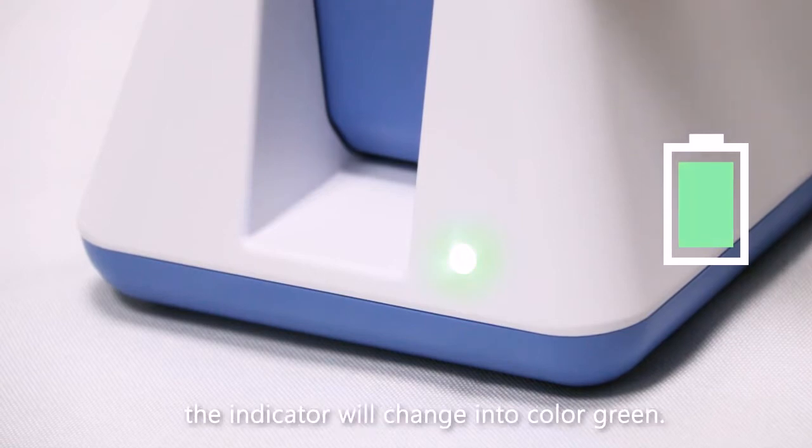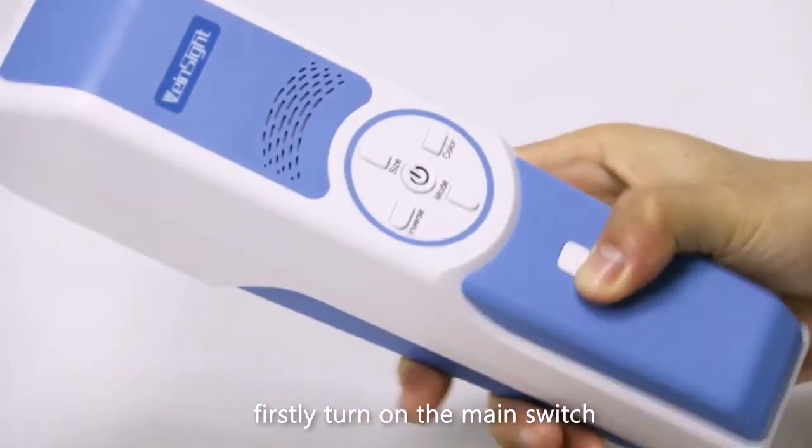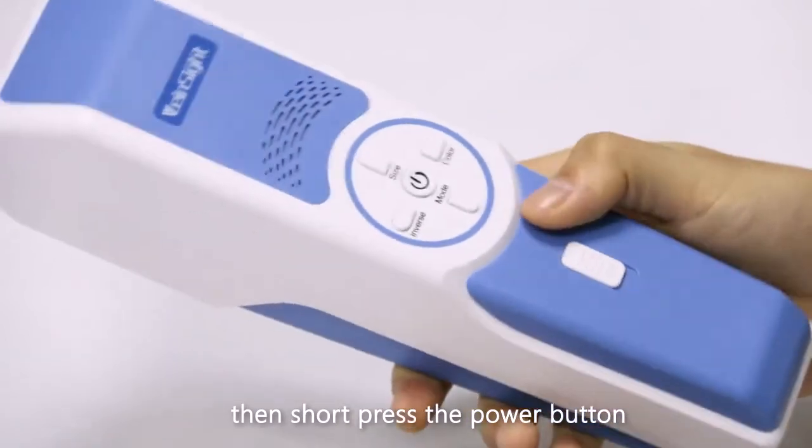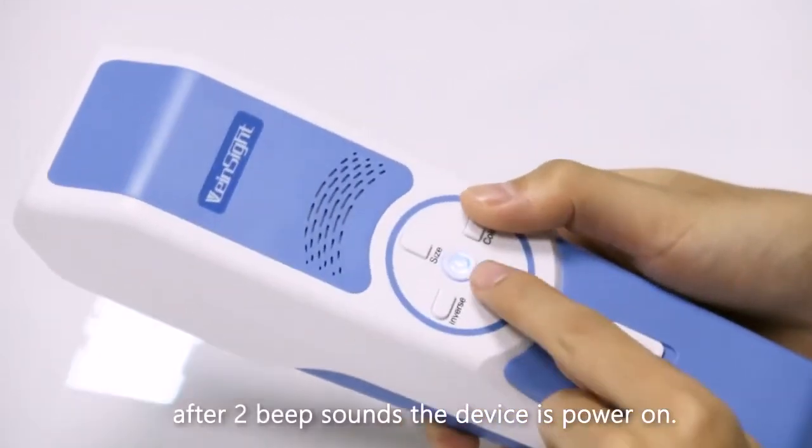When the battery is fully charged, the indicator will change to green. To power on the VS 400, firstly turn on the main switch, then short press the power button. After two beep sounds, the device is powered on.